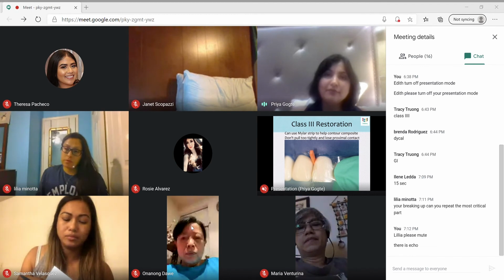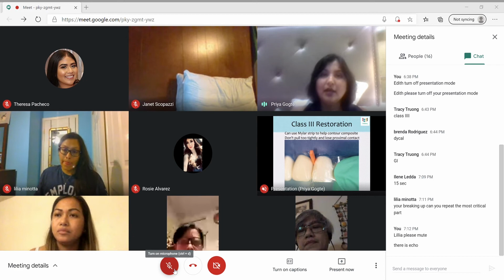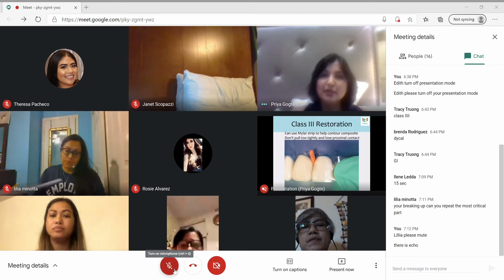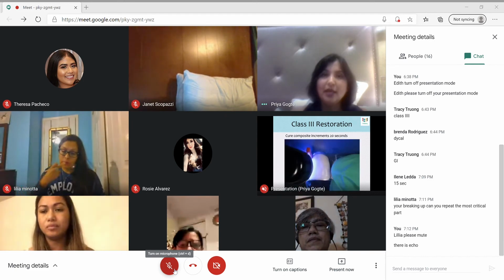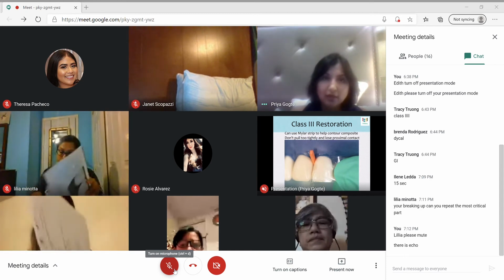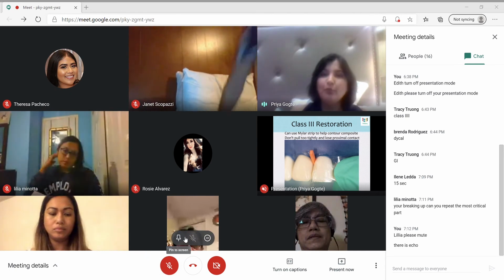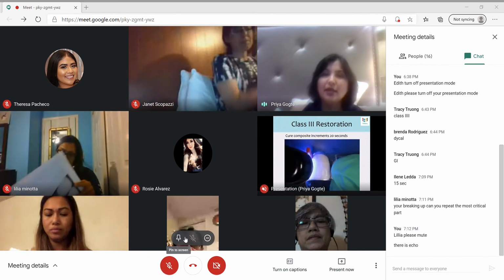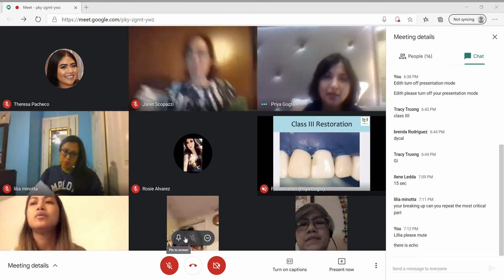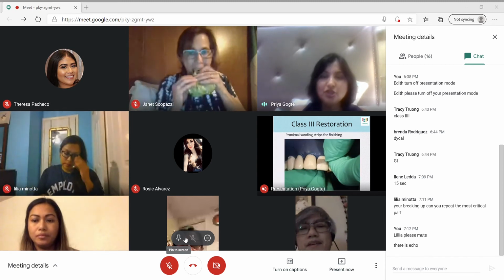So once you have done the composite filling, everything is looking good. You start taking out the wedge and the mylar strip slowly, carefully. And after you've cured all the composite, in this they're saying you just use a mylar strip to kind of help you contour it. And then you cure the composite, and you are all done. And then make sure your contacts are good. The flash, you want to remove.